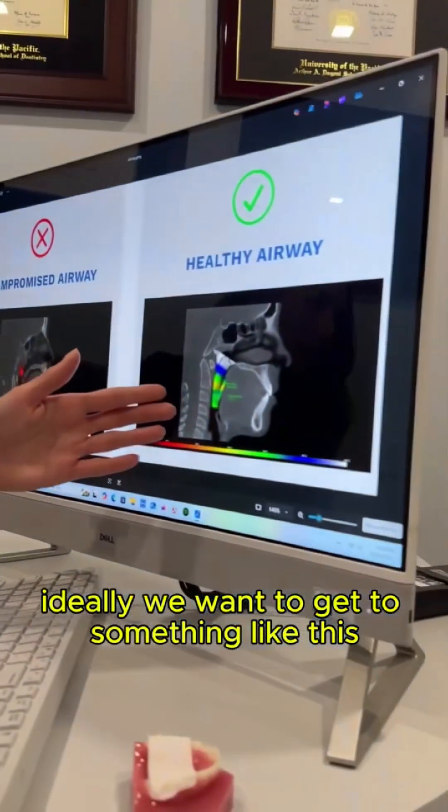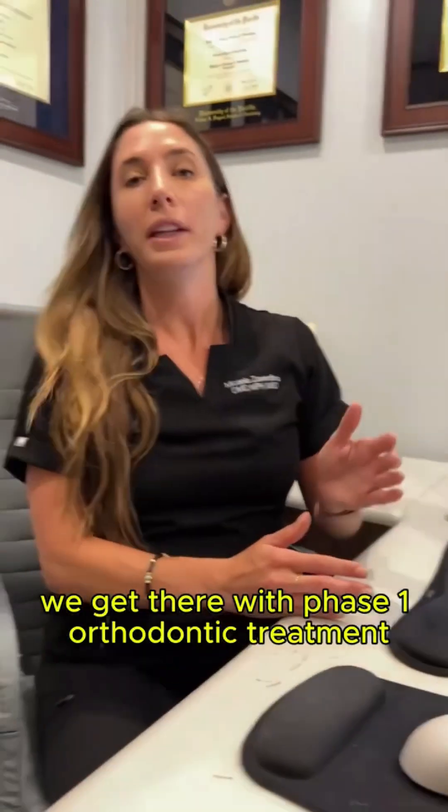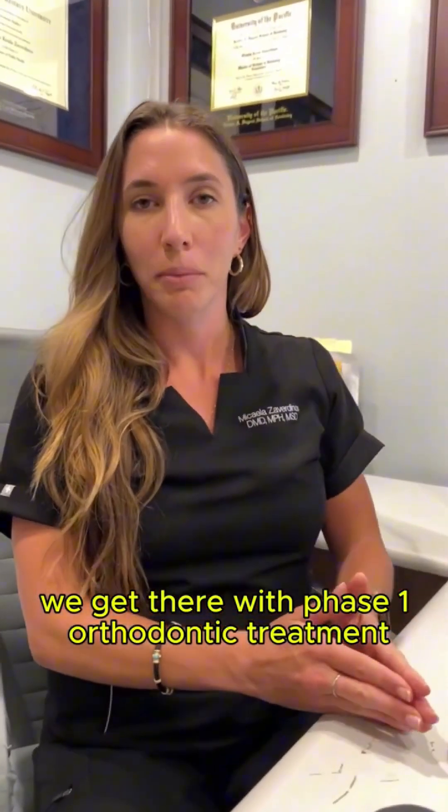Ideally we want to get to something like this where the airway is opened up. How do we get there though? We get there with phase one orthodontic treatment.